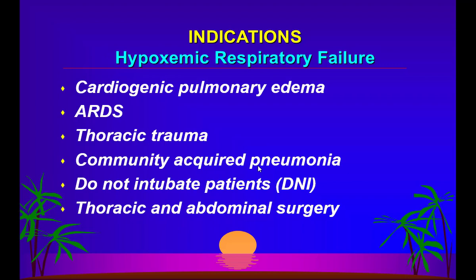In fact, for patients of bariatric surgery who have obstructive sleep apnea, it is recommended that you must use non-invasive ventilation post-operatively, right? That's very, very important. What you do in bariatric surgery before you close, actually, they put liters and liters of water in the stomach to check for a leak. A lot of pressure is already applied. So it is just a misconception that non-invasive ventilation in these patients can lead to wound dehiscence. If it is indicated, definitely you have to use it.